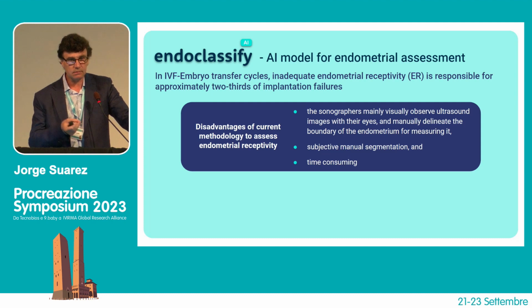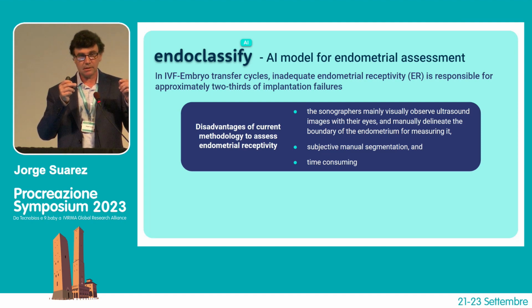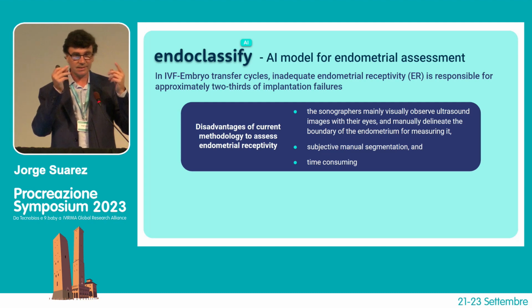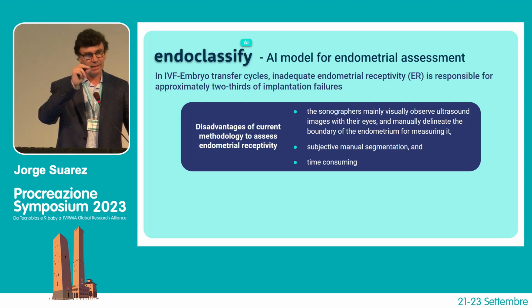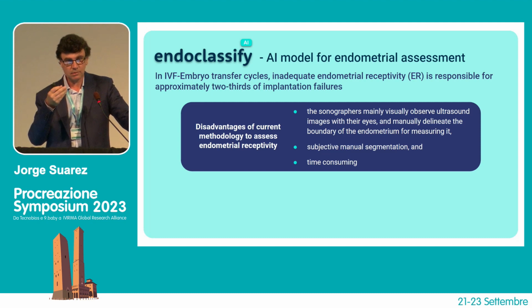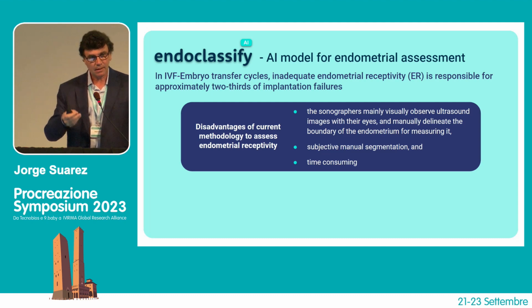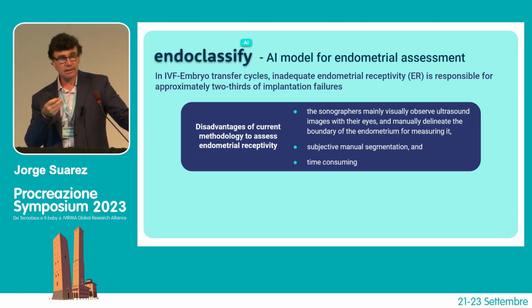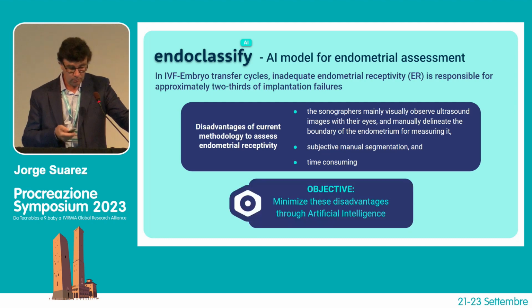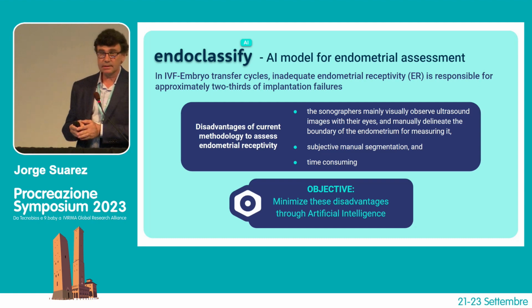One disadvantage is that the sonographer mainly observes ultrasound images visually, with their own eyes, and manually delineates the boundaries of the endometrium. It is also subjective manual segmentation, because we don't have any tools. We are only seeing the screen. And all of these operations are time-consuming. Our proposal is to minimize this through artificial intelligence.